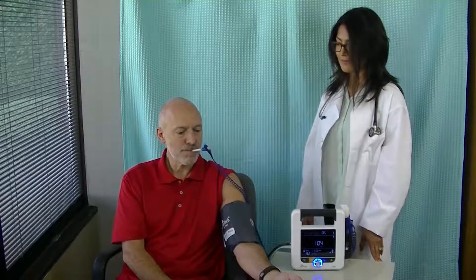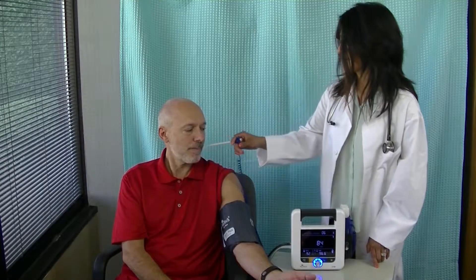Each measurement will display when complete. All should be ready within about 30 seconds. Measurements can be taken in any order, but this sequence is optimized so the longest measurement, blood pressure, is started first.